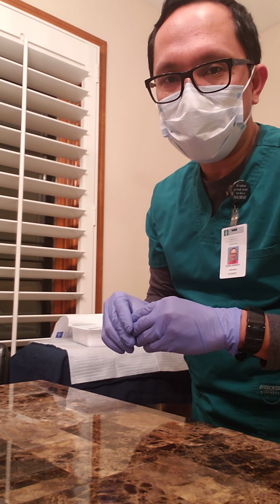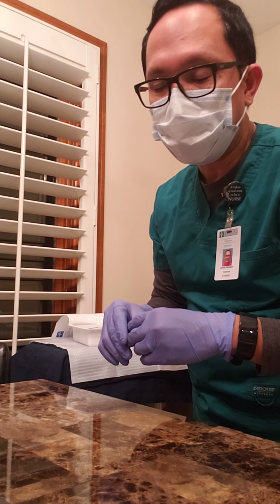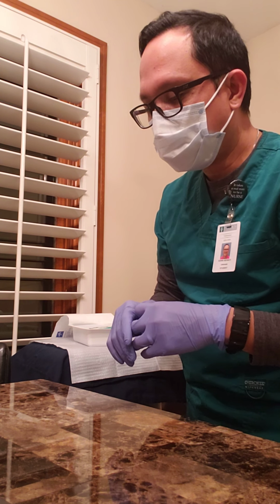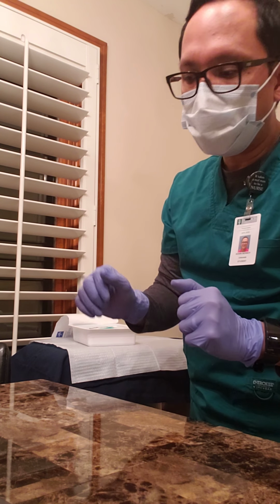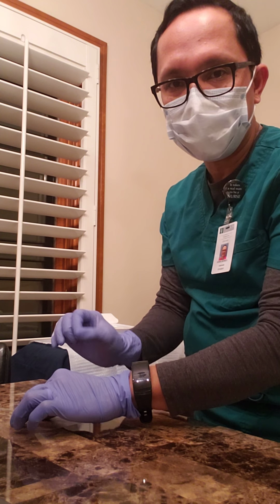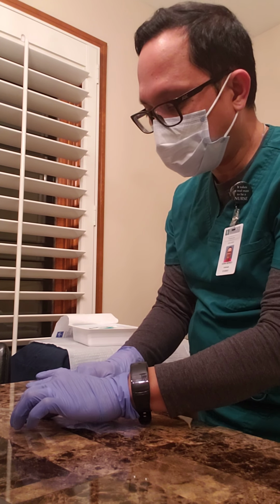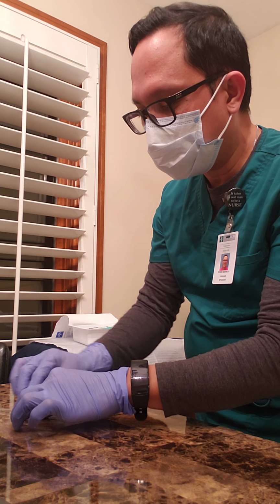If the patient has a secure lock device and an antimicrobial patch, this is also a good time to take it out. But before you take it out, make sure you wipe the side of the secure lock device with alcohol, and then you gently take it out.